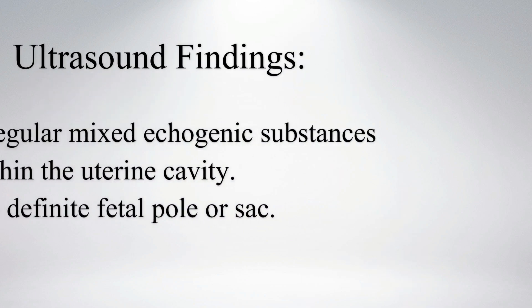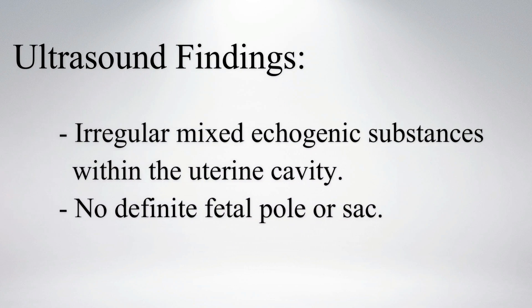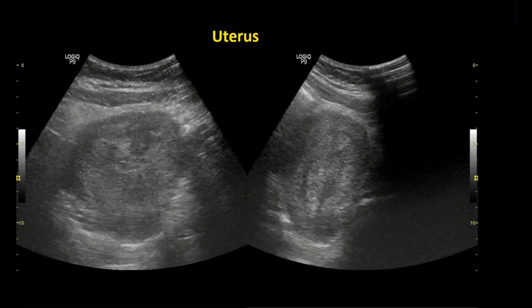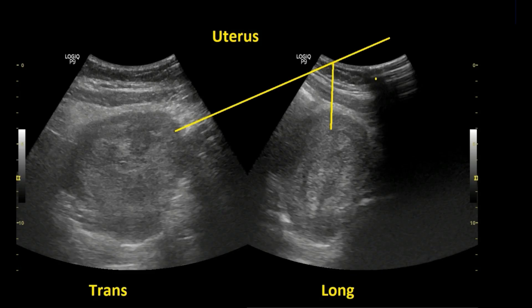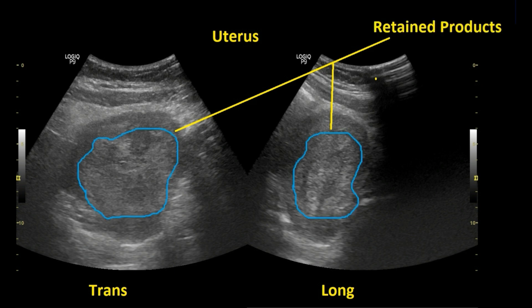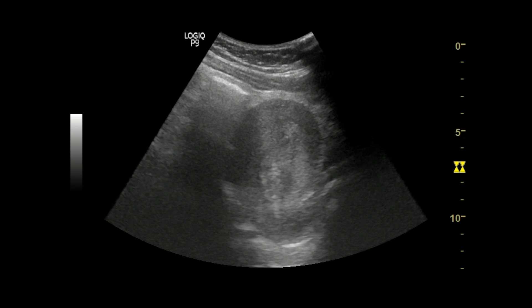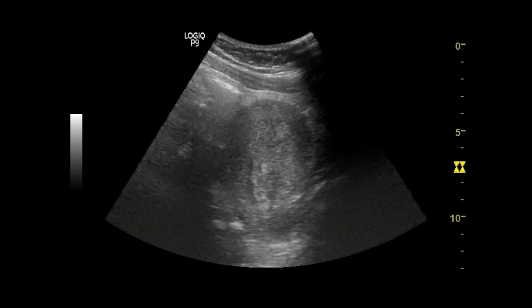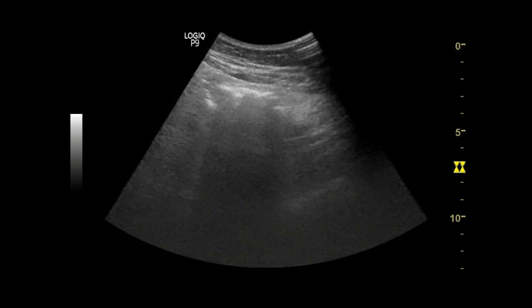On ultrasound, irregular mixed echogenic substances are present within the uterine cavity. No definite fetal pole or sac was visualized. The patient had an empty bladder and came at the emergency. Now we can see a bulky uterus with inhomogeneous internal content. These mixed echogenic substances at the center of the uterus are retained products.